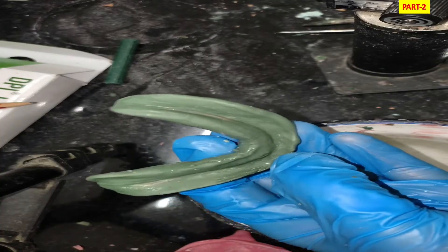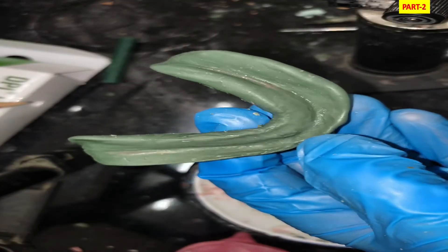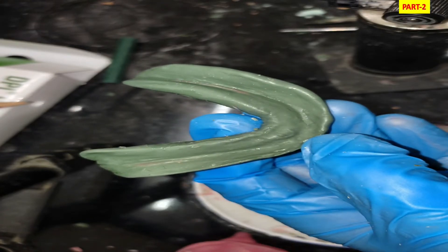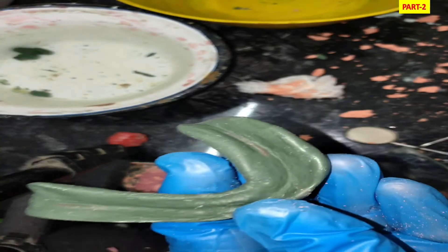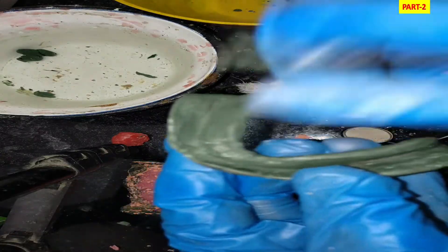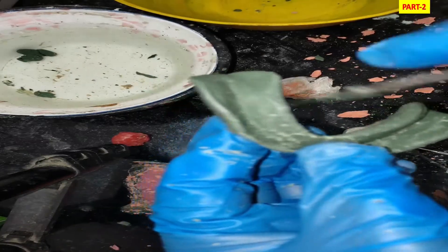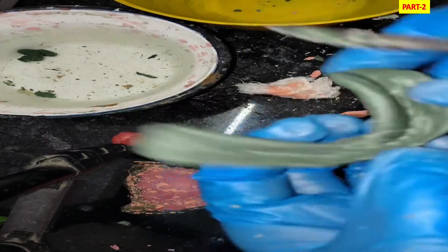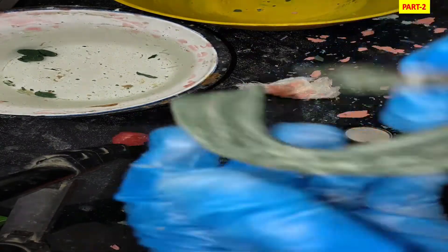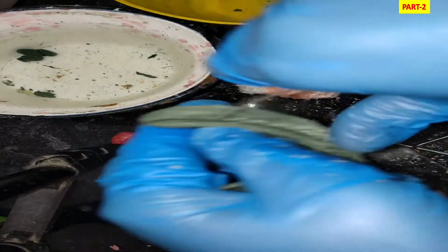Why do we use impression compound and green stick compound together in the McCord technique for resorbed ridges, rather than the conventional method? This composite admix material exhibits greater flowability and therefore better recording of fine details, making it especially useful in poor ridge cases. In the conventional technique, a spacer provides space for the wash impression, but in the McCord technique we scrape the impression with a BP blade to create that space.